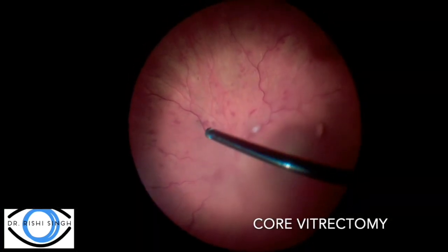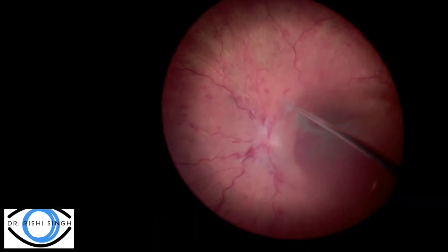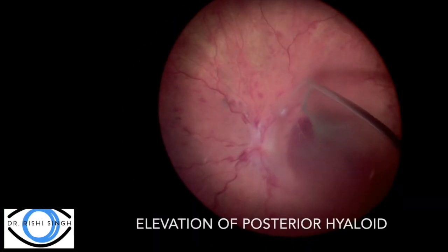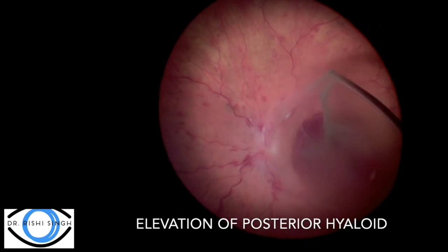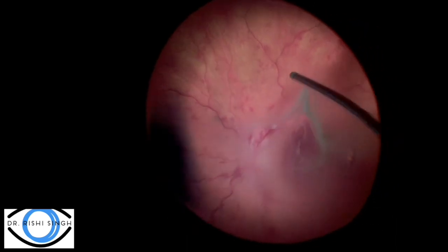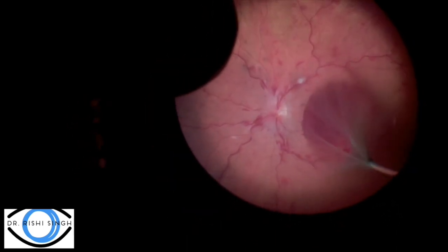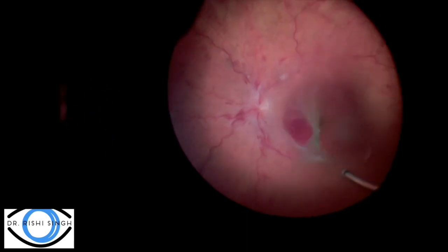As there was no clinical improvement, the patient was submitted to vitrectomy. After the elevation of the posterior hyaloid, the surgeon noticed the hemorrhage was actually in the sub-ILM space.